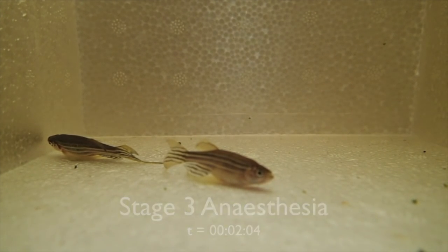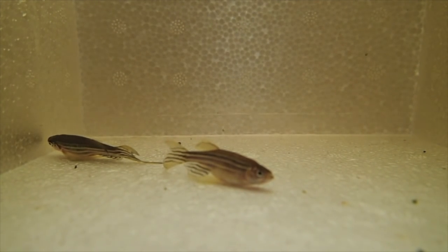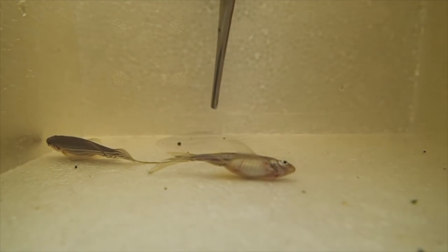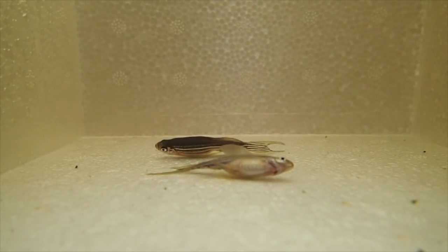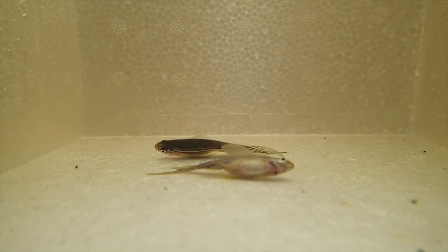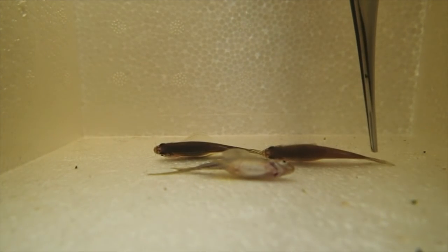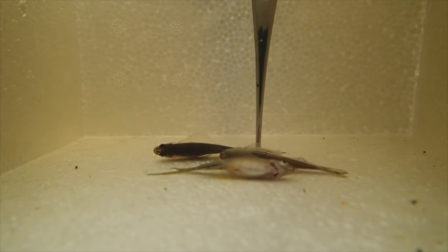Now we'll move into stage 3 of anesthesia. Here there's partial loss of equilibrium and muscle tone — you may have erratic swimming and increased respiratory rate, and they react only to strong stimuli. Different fish may react differently. This is sort of the excitatory phase, but they don't look all too excited at the moment; some fish do go through that more noticeably.